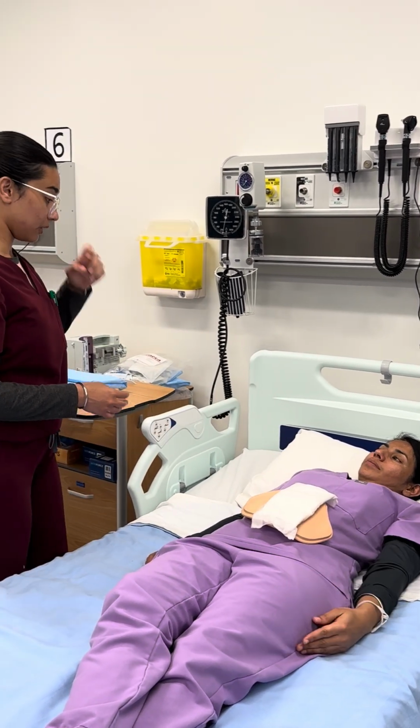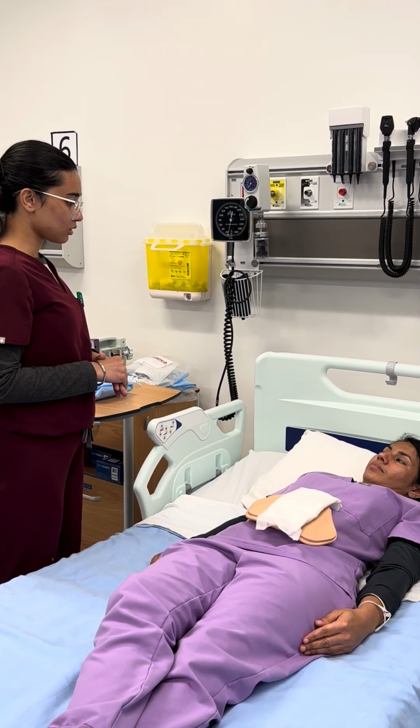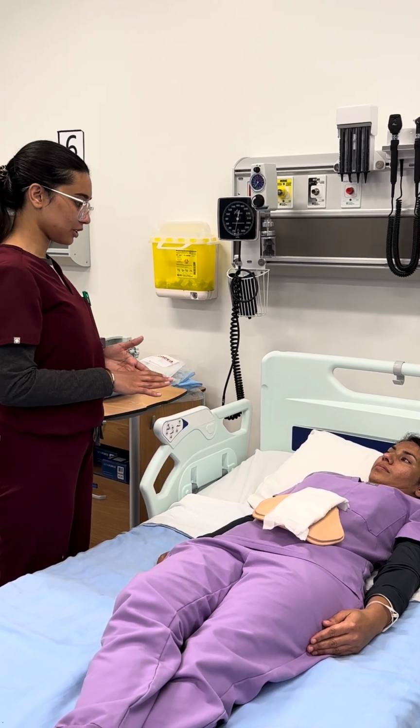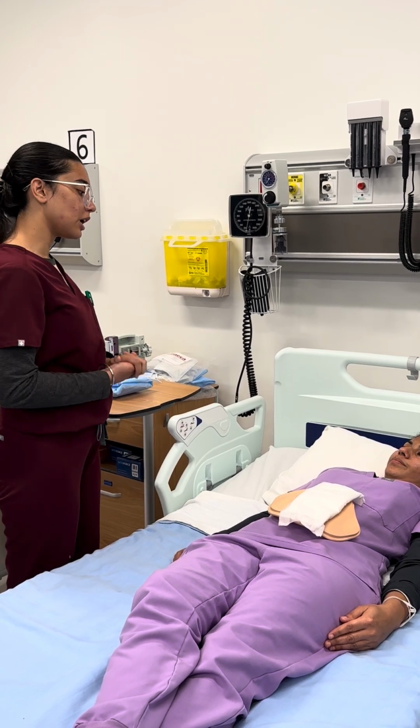Okay, so I've reviewed your treatment chart and the physician has ordered the change of the wound dressing. So basically I'm going to remove the old dressing, clean the wound and then replace it with the new sterile one. Do you consent to the procedure? Yes. Okay, before beginning the procedure I'm going to ask you some questions.